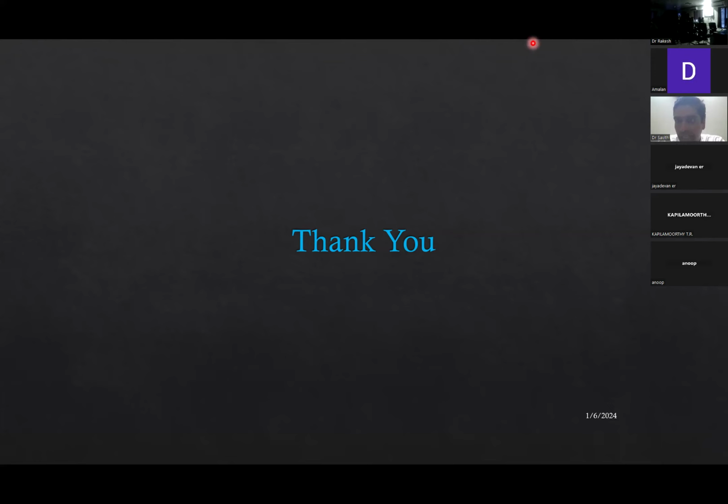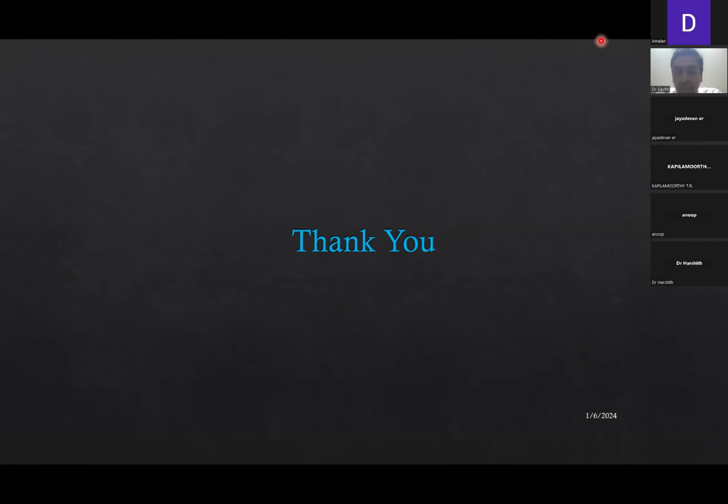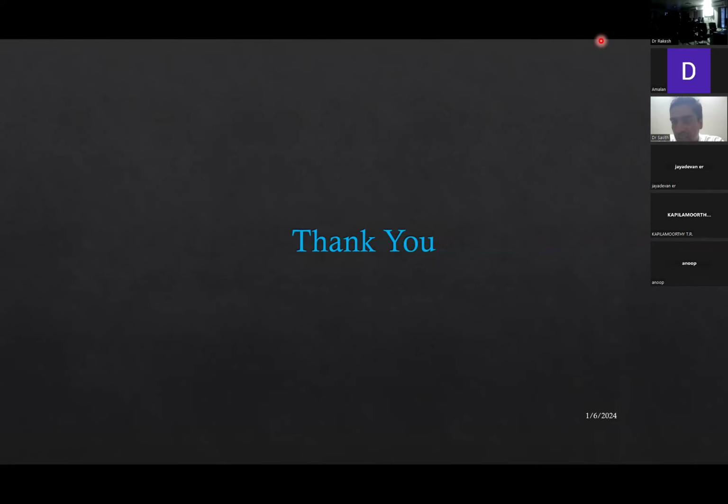So, I've shared cases. If there are any questions, or any queries or suggestions on how these cases have been managed, it'll be open for discussion. Okay, thank you, Savith. Anybody, any questions?